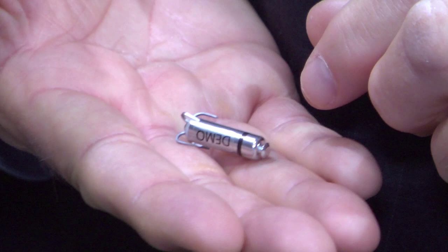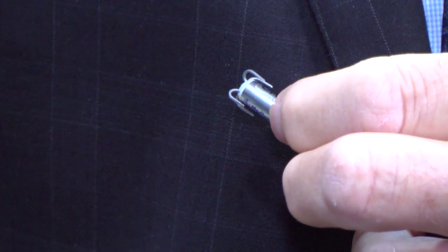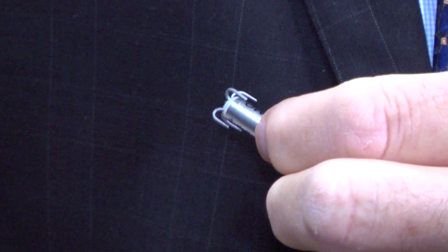The precise device is what you have in your hand. I do. Look at that thing. That is pretty small. It is. One of my friends just described this as looking like a .22 caliber bullet. I don't think of it that way, but it is about the size of a .22 caliber bullet. It's positioned using a catheter-deliverable technique from the femoral vein, maneuvered into the right ventricular apex or the right ventricular septal area, and it's fixated there by these very flexible nitinol tines.